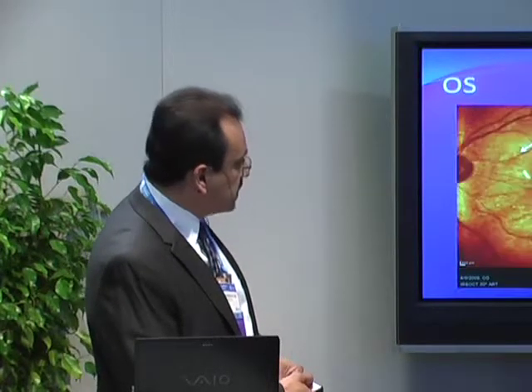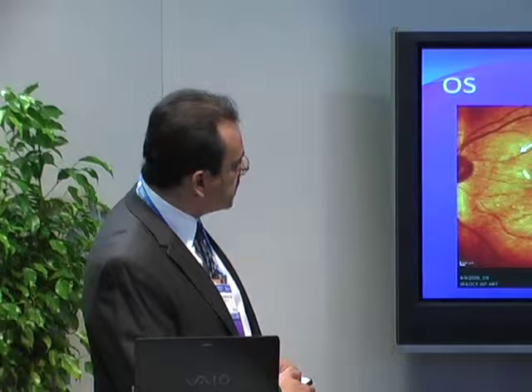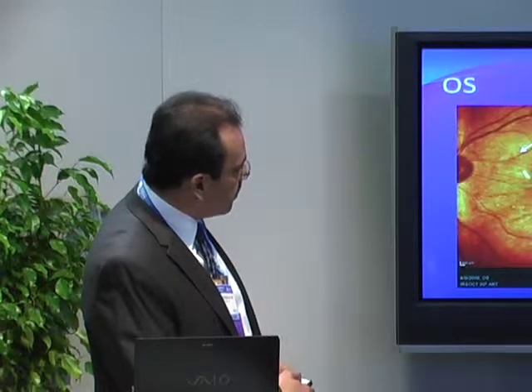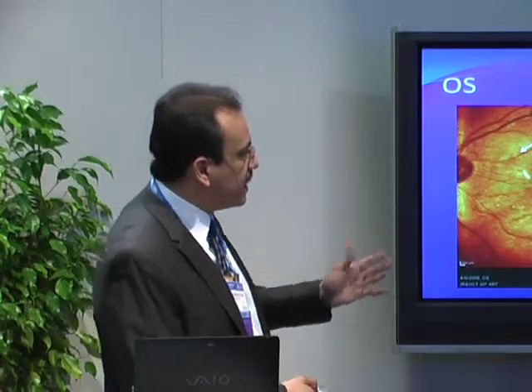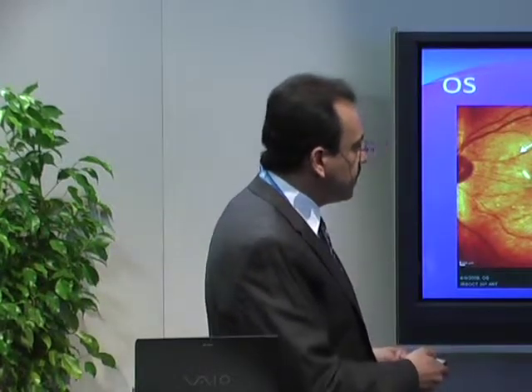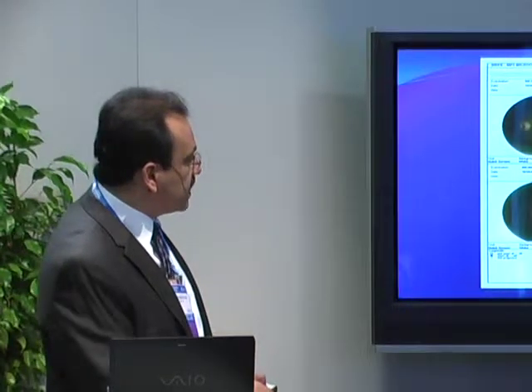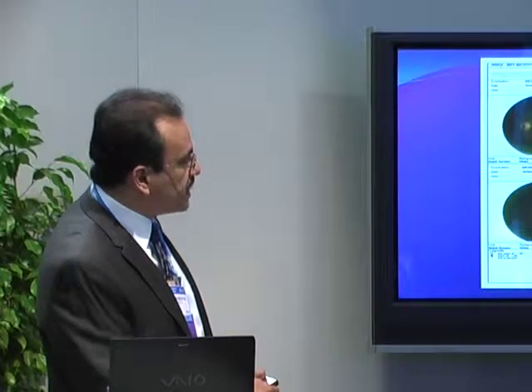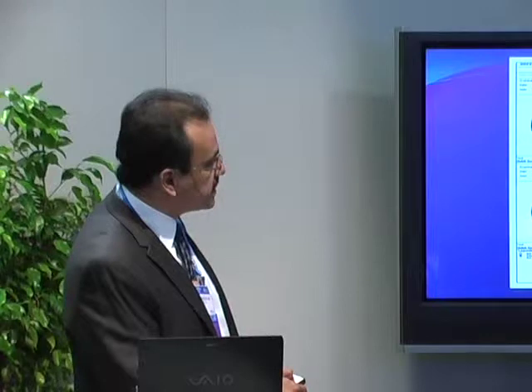So not surprisingly, this individual has a complaint in that eye, and I'll show you the MP1. But at the same time, you can see this OCT. You can see an epiretinal membrane here and a lamellar hole, maybe some edema, some hard exudates from the diabetes. What do you do about this patient? Again, another example of how the anatomical changes here really don't correlate with the function of the tissue below that. You can see in this left eye, although there is a reduction centrally where you have the lamellar hole, the patient is still doing well because the sensitivity is better right around that.